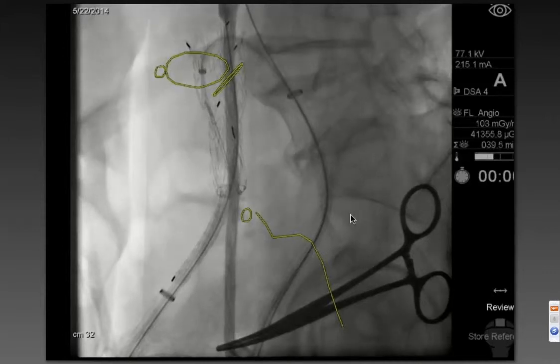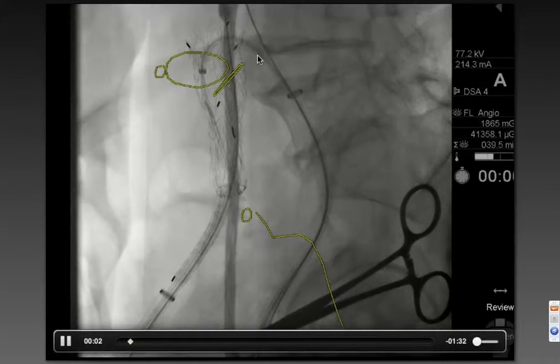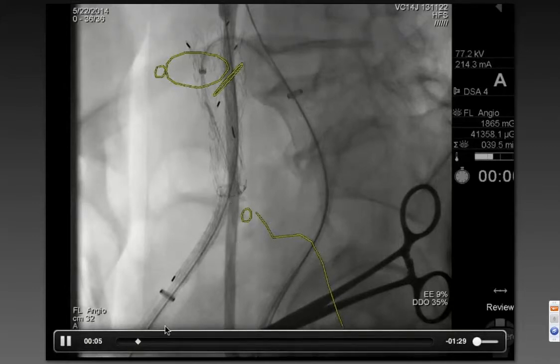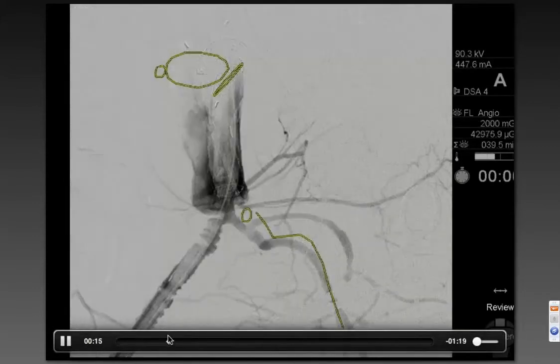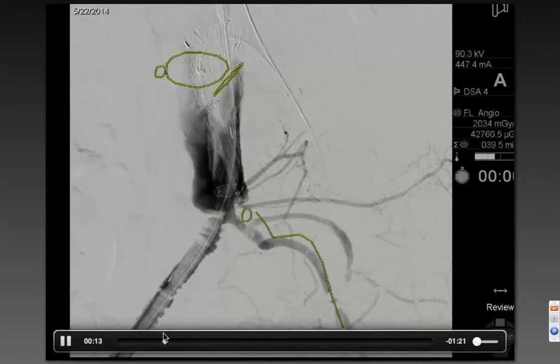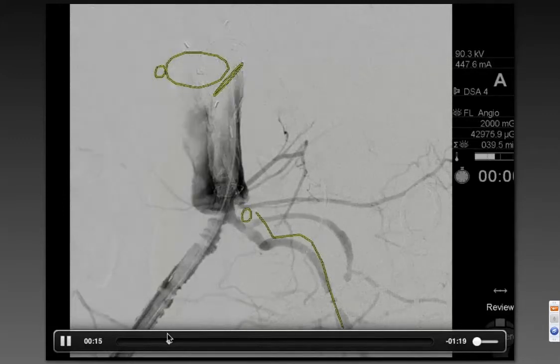Here you can see the sheath up and over the bifurcation, and we can advance this down through that gate. This is not going to be easy because there's an aneurysm and there's a tight stenosis. I'm sure a lot of you are going, oh my gosh, I'm going to put two devices through that stenosis. Yes, we actually did.